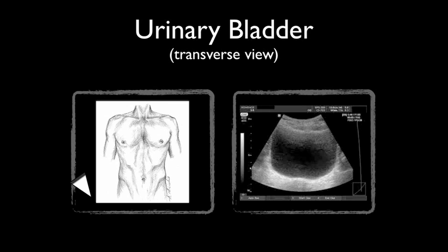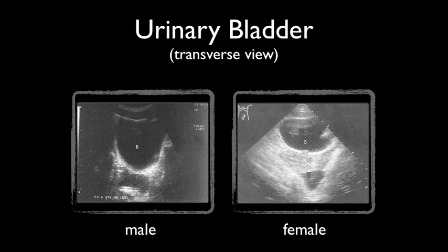To visualize the urinary bladder in the transverse plane, place the ultrasound probe approximately 2 cm superior to the pubic symphysis. Here's an example of a full urinary bladder. In these two examples, free fluid can be seen posterior to the bladder. In the female scan, note the position of the uterus between the bladder and the free fluid. This is the pelvic cul-de-sac, or the pouch of Douglas, which is another potential space between the uterus and the rectum. Best images are obtained when the bladder is full.